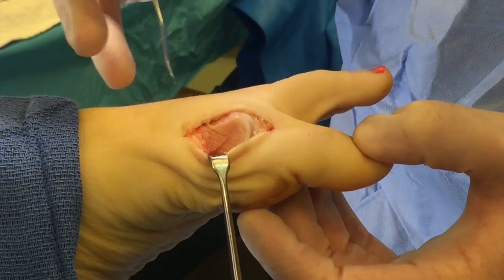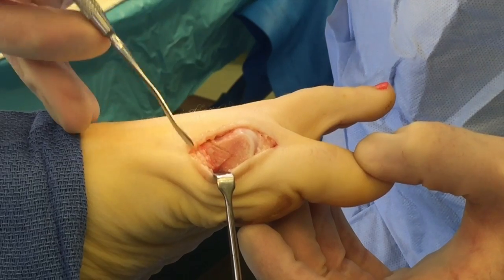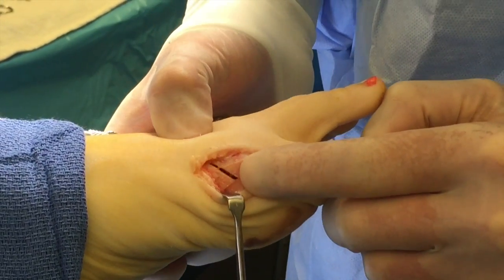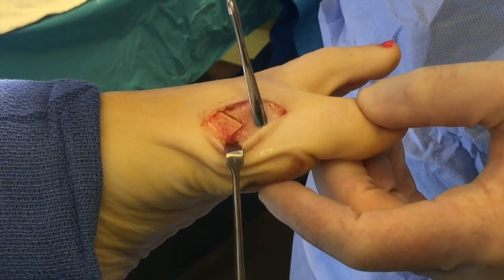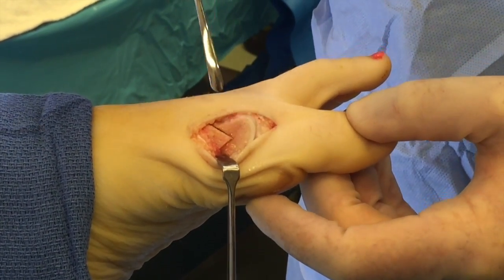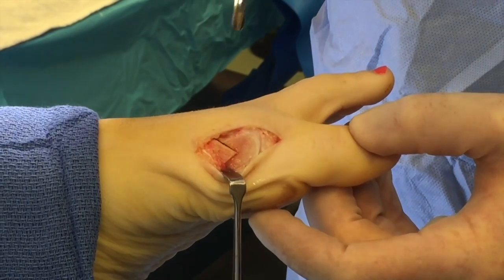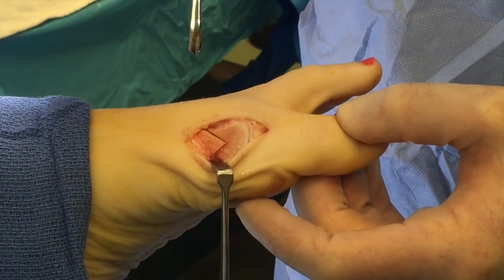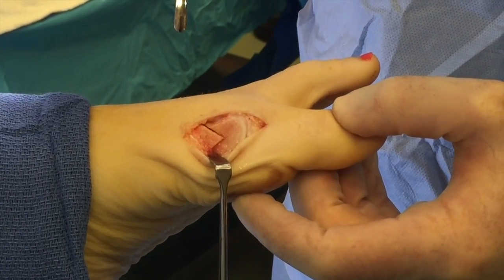Now that we have the incision made, the V-osteotomy, or chevron osteotomy, is here on the side of the head. What's beautiful about this procedure is you can literally move the head over — you can see I just moved her bunion deformity, the entire head, over about three millimeters. In a little while we'll go ahead and fixate the osteotomy with those naturally occurring absorbable cortical bone pins called the TinFuse.